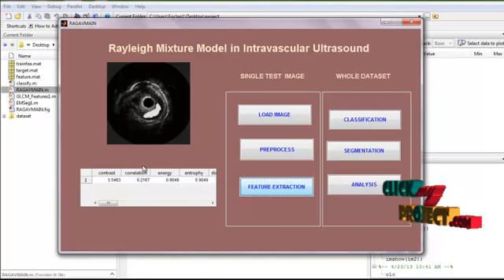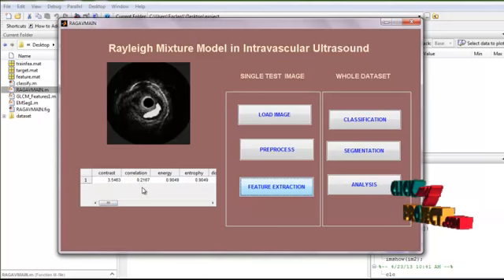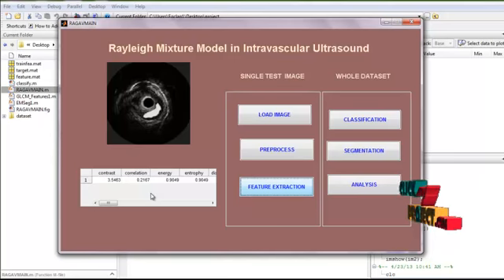Normalize the GLCM: divide each element by the sum of all elements. Each element of the GLCM may now be considered a probability of finding the relationships. Calculate the selected feature. This calculation uses only the values in the GLCM. Several statistics are derived using different formulas.